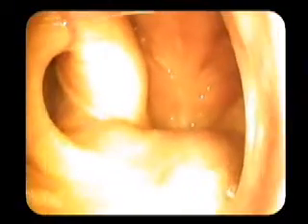Here we are in the nasal cavity. In the back of the nose, I will have the patient undergo several speech tasks. Say, Pa, Pa, Pa.